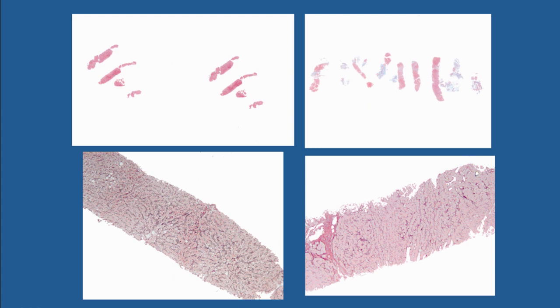The reticulin stain has always helped me in making that distinction. So here we have a reticulin stain that shows a very, very normal pattern. And this makes me think that this biopsy was fragmented because of the procedure. Whereas I look at this one and I see a very abnormal reticulin pattern, and coupled with the trichrome stain, I'm then quite confident that this is actually a case of advanced fibrosis, meaning bridging fibrosis or cirrhosis.